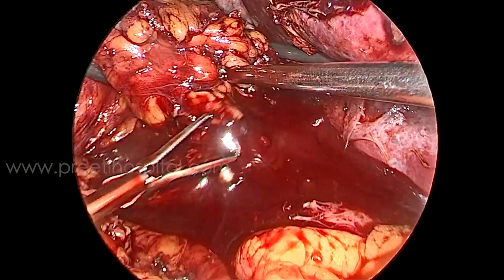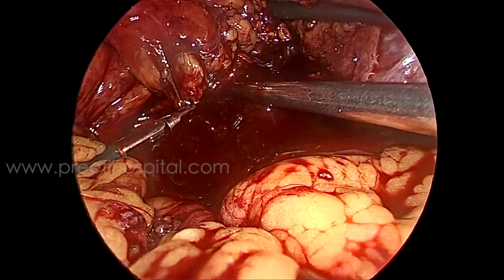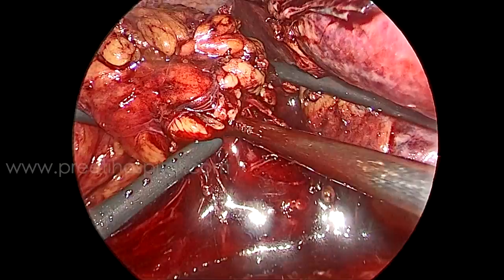By stretching first, we can identify where it is bleeding. With a soft clamp you can close it — nothing will happen. I got a little breathing time but it bled again, because it's a vein — it usually doesn't stop. It does not retract, it does not go into spasm, and it will continuously bleed.